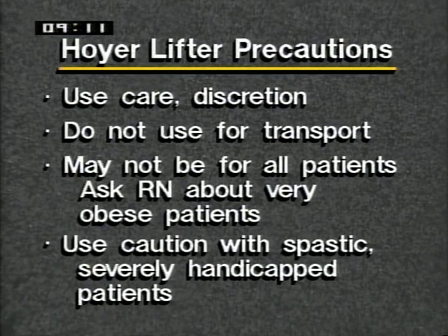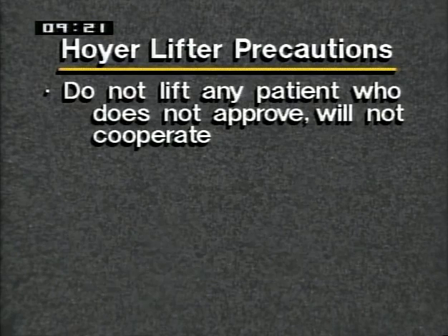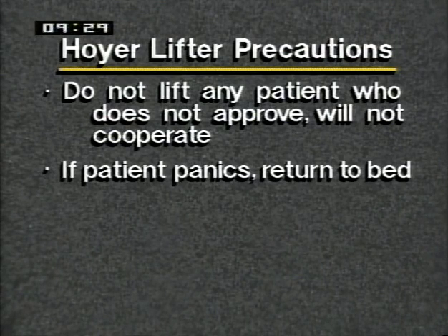Patients who are spastic or severely handicapped require extreme caution if they are transferred with the Hoyer lifter. We recommend that you seek instruction and guidance. Do not attempt to lift any patient who does not approve of the transfer or who will not cooperate. If the patient begins to panic during the transfer, immediately reverse the procedure and return the patient to bed.